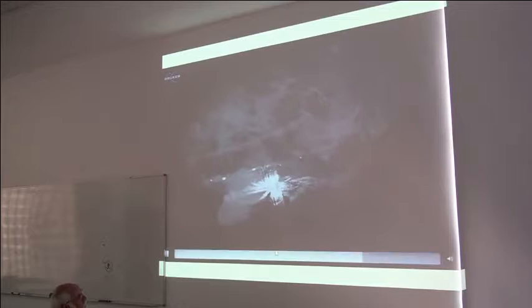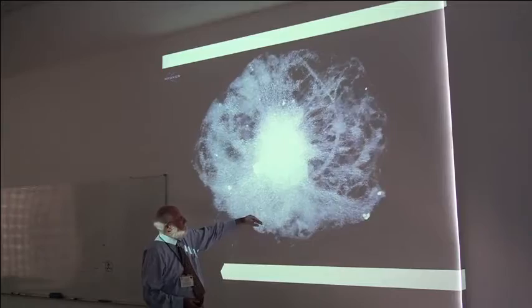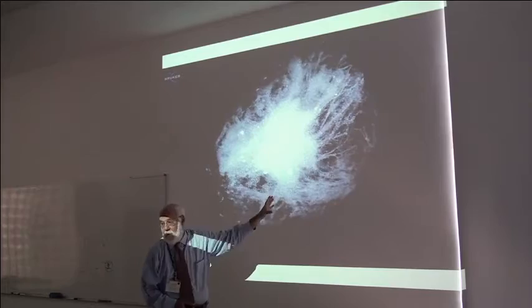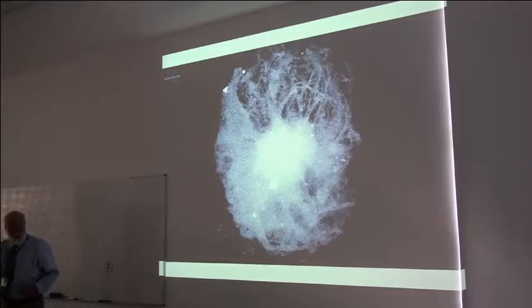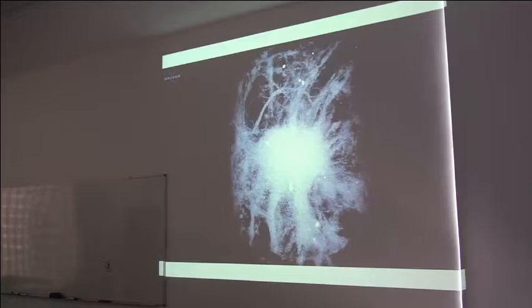So you roll this around a few times and you begin to appreciate this. This is a different visualization. Here we've kind of pixelated it. This is a good cancer because you can see it's this solid area in the middle, but doesn't seem to touch the edge. Your brain slowly begins to see, yes, there are little streams and wires and blood vessels, but the cancer is nicely inside in the middle. So the whole computer image analytics aspect of learning how to prepare these pictures to let the surgeon and the pathologist better make sense out of what they're seeing is an important task ahead.